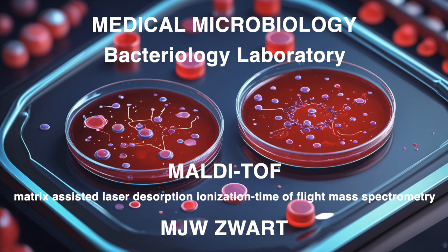Okay. Calibration, on the other hand, is more like fine-tuning. You're adjusting the instrument to make sure it's accurate, usually after maintenance or cleaning. So validation is like checking your vitals, and calibration is like getting an adjustment, making sure everything's aligned. Perfect analogy. And for daily validation, our trusty Bacterial Test Standard, BTS, takes center stage again. Can't get away from it.